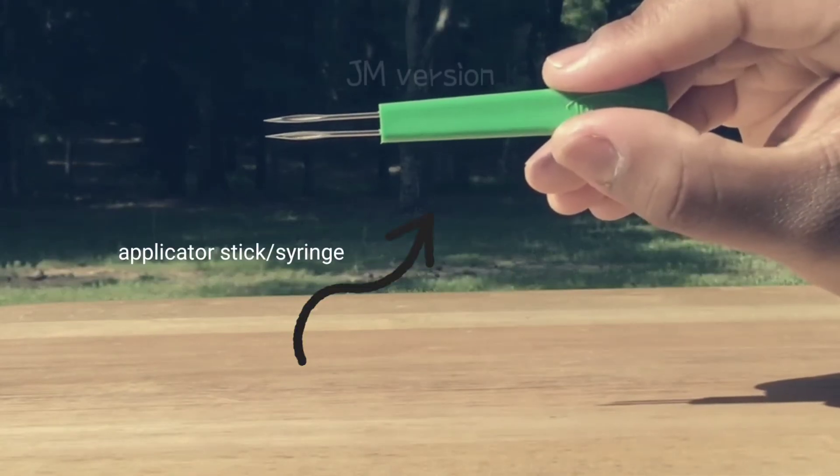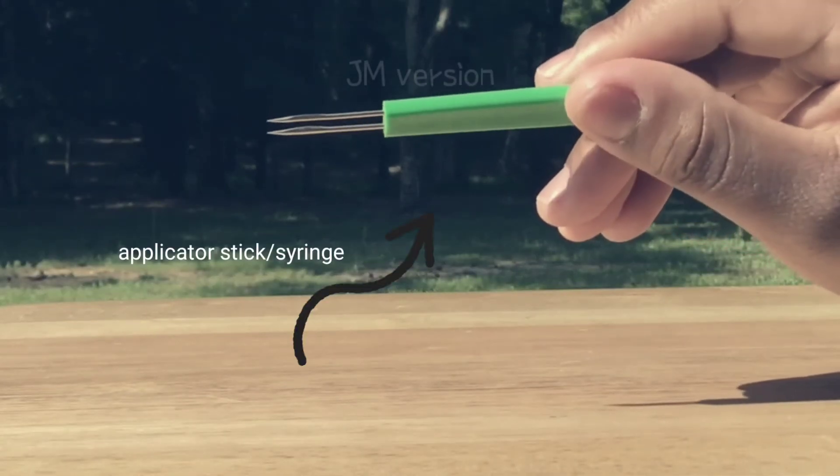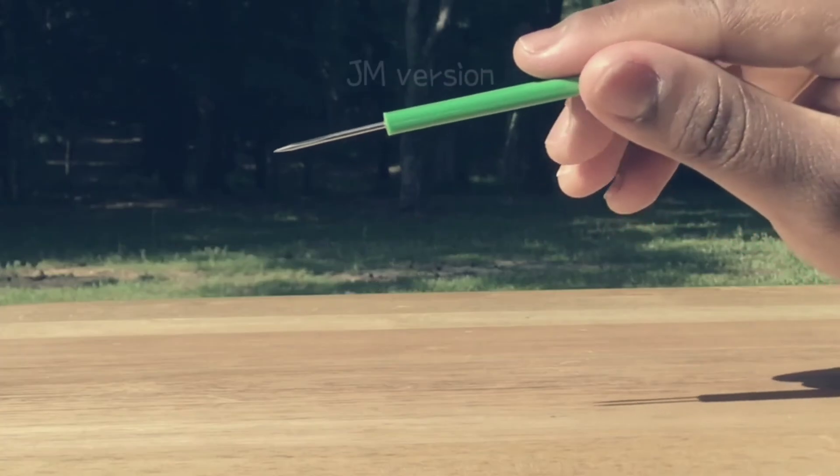The Fowlpox vaccination applicator stick has two sharp prongs with grooves on the side of both prongs.